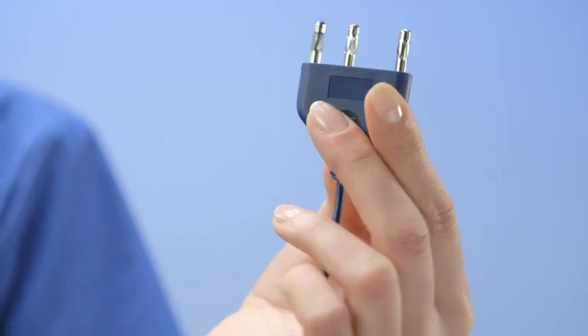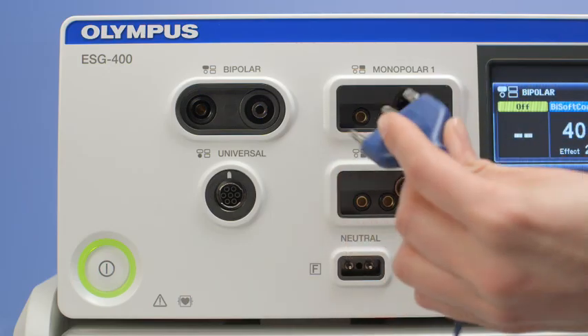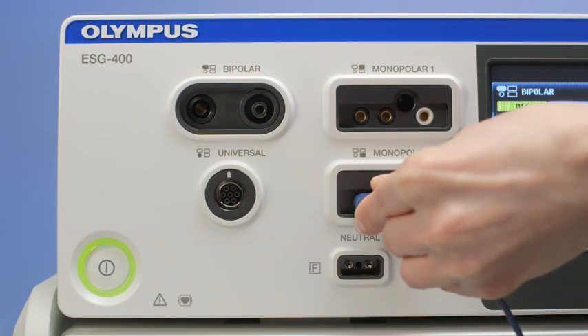If you use the three-pin international plug, you can only connect it in one direction. It is very easy — you either use monopolar one or monopolar two.